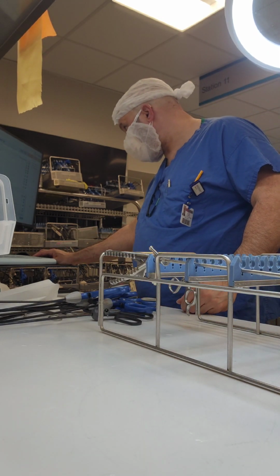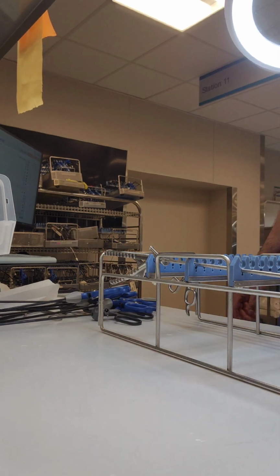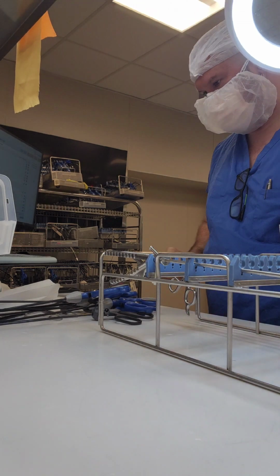Okay, and I don't put the handles all on the same side so it can fit on the rack a little bit more spacious, so you don't knock one out.